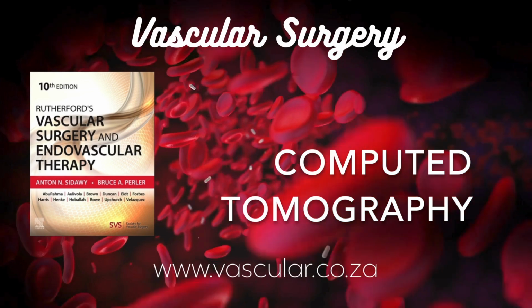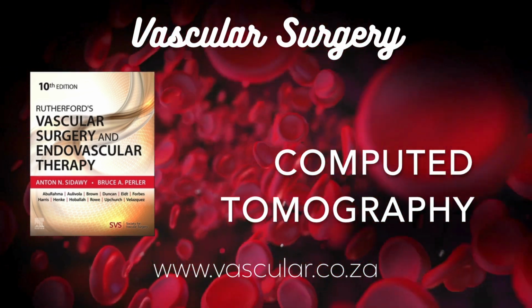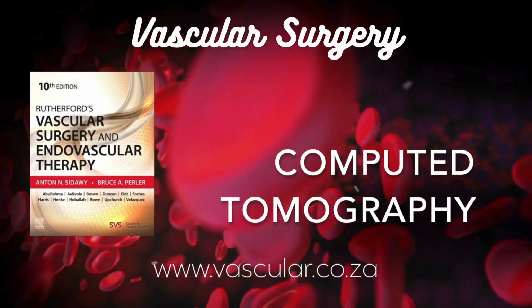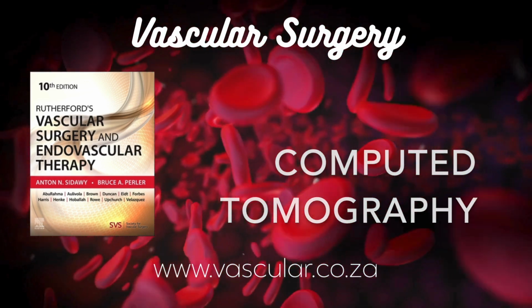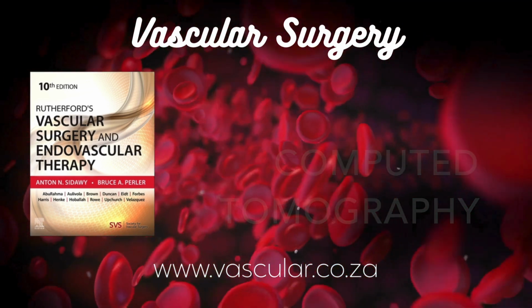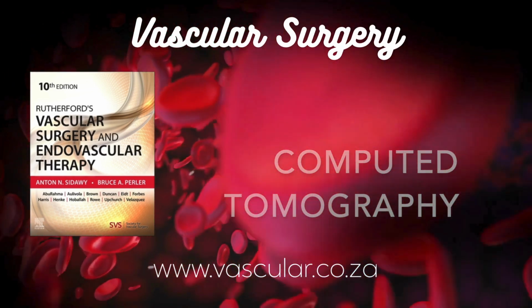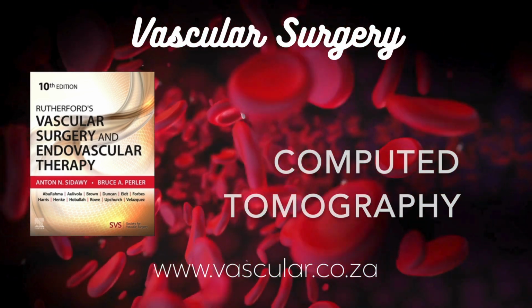Trade-offs again. Okay, we have the data, maybe reconstructed it cleverly. What other post-processing can make these images even more useful? One of the most powerful and routine things is multiplanar reformatting, or MPR. Remember, we acquired a 3D volume of data. MPR lets us slice through that volume in any direction we want, not just the original axial cross-section view. It's like front to back, side to side. Exactly. Coronal views, front to back, and sagittal views, side to side, are standard.